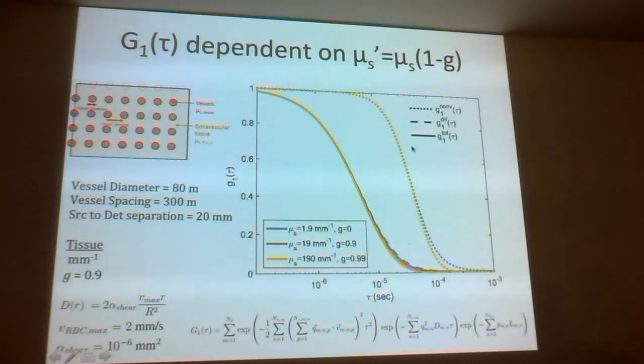One possible explanation, and I want to address this with OCT, and maybe you already have the data, is that the shear is greatest at the surface of the vessel, where the speed is the least. From a cross-sectional area argument, the vast majority of the red blood cells are near the vessel wall, where they're moving slowly but have high diffusion. So the prediction with OCT is that if you measured a laminar profile and could distinguish diffusion from linear motion, we would characterize greater diffusion near the vessel walls and less where we've already measured less speed. That's a prediction that I think OCT could confirm.